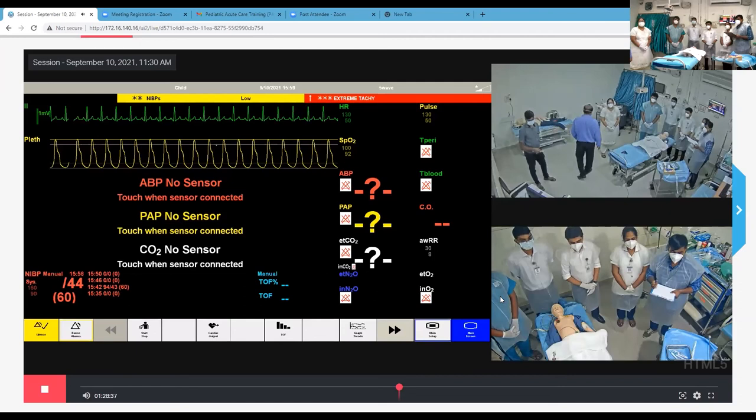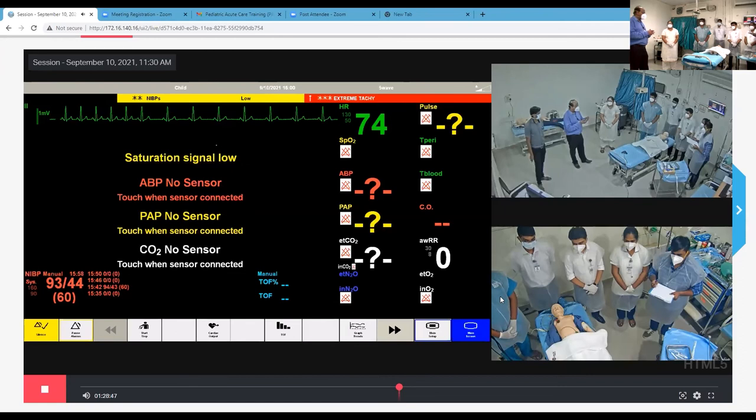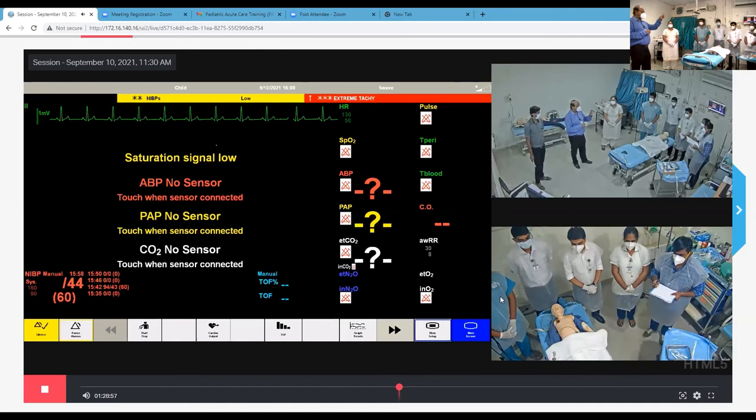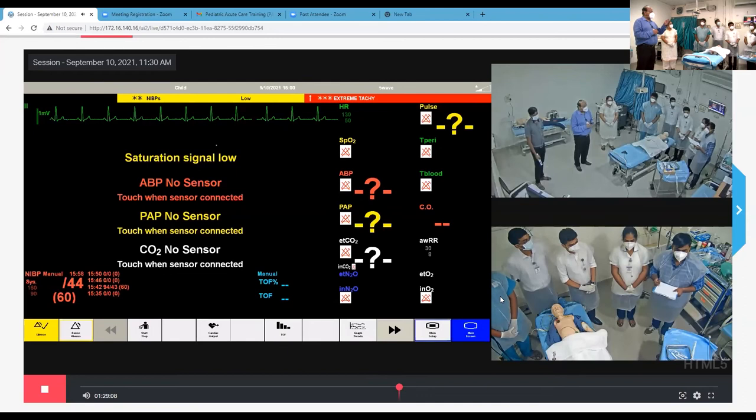So thanks, Vandana. You just narrated what happened. Your team dynamics was good. I could notice that there was leadership, followership and closed loop communication. Your messages were clear. Thank you, team, for that wonderful job. So here are just some learning points. I'll go back to the rhythm that you are seeing on the monitor. Those who are listening, you can see on the monitor, there is a rhythm. Can you take out the blood pressure, please?